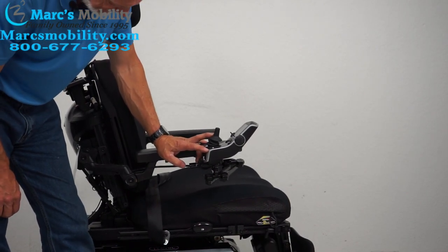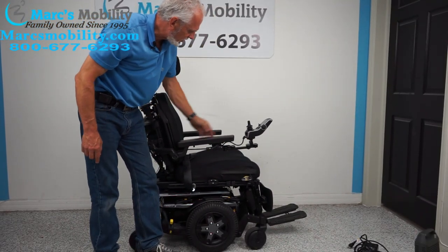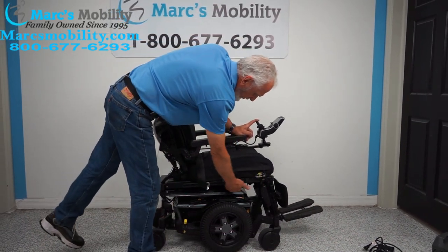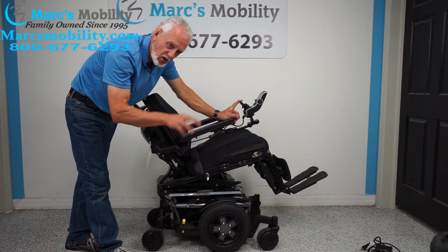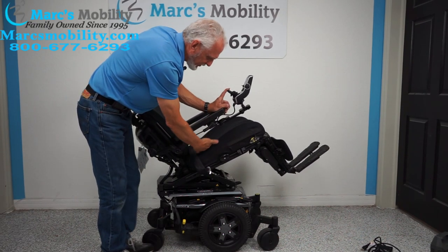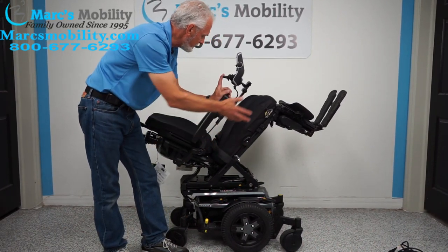Now I'll bring the seat all the way down. The next feature is the electric tilt. I want the bottom and the back both yellow for tilt. By pushing the joystick back, the bottom goes back — this is the tilting positioning. It takes the legs and the back together since they're all connected. Electric tilt is good for relieving pressure off your bottom, your lower back, for circulation, or just to relax.